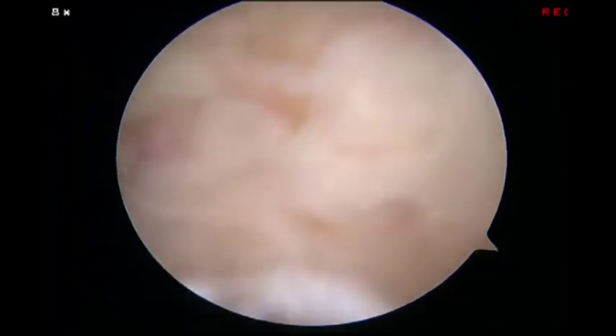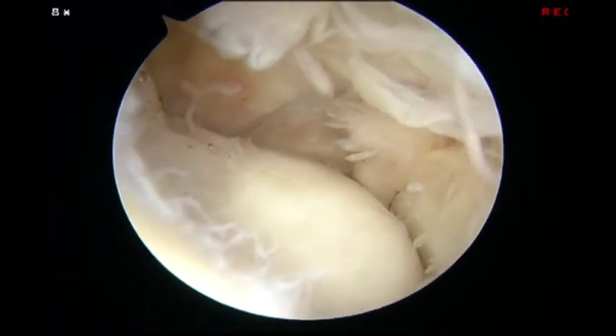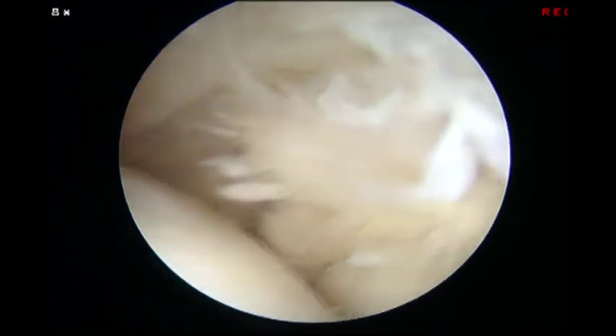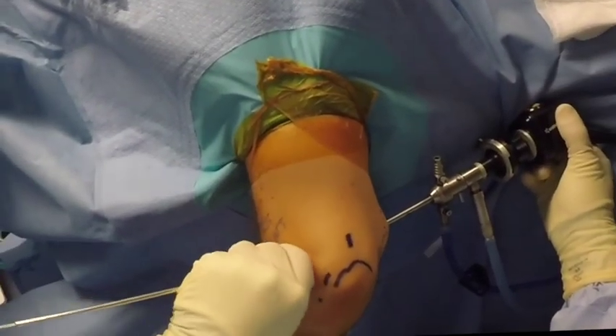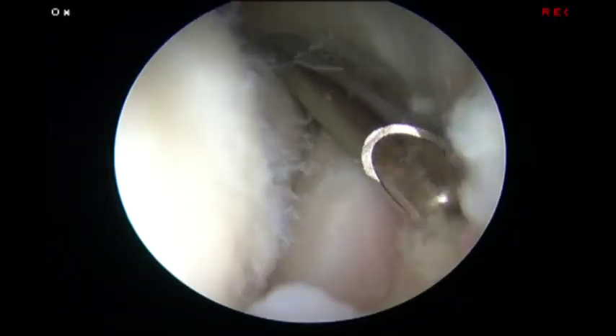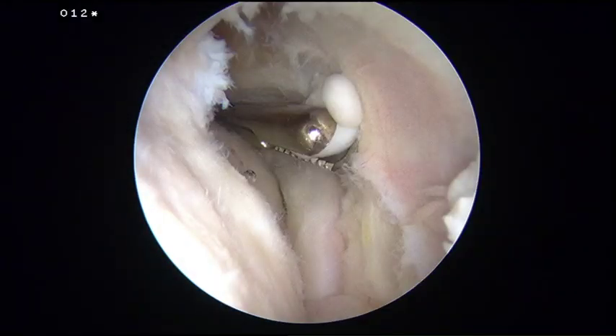Extensive synovitis as well as multiple osteophytes and loose bodies were noted in the radiocapitellar and ulnohumeral joints. The proximal anterolateral portal was established as the working portal. A thorough debridement of the synovitis was performed with a shaver and loose bodies were removed with a grasper.